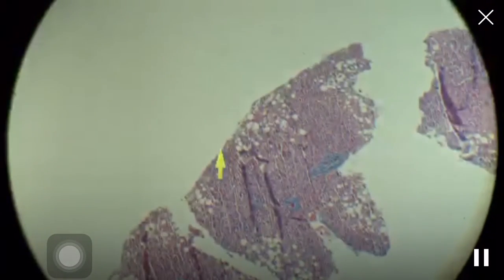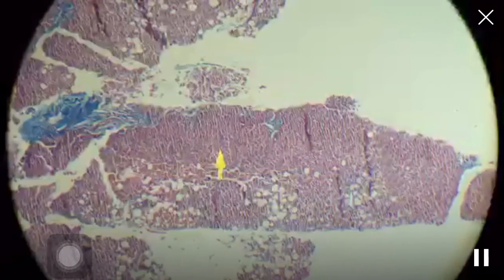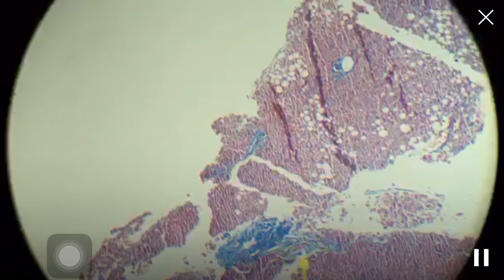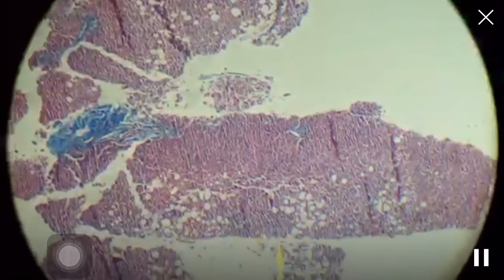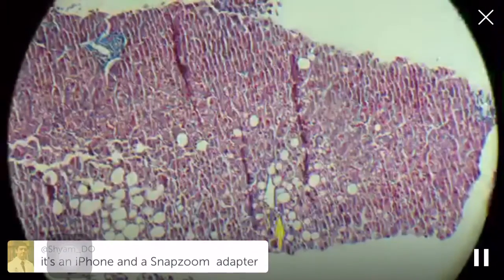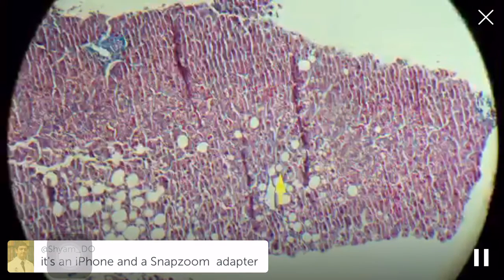And then I go to the trichrome to look for steatofibrosis. A little bit around the central vein. Well, that's a portal tract. That's a portal tract. That's a portal tract. That's a portal tract. The central veins are in where the fat is. And I'm not seeing any. That looks like a beautiful central vein. So there's no steatofibrosis. So this only has fatty change.